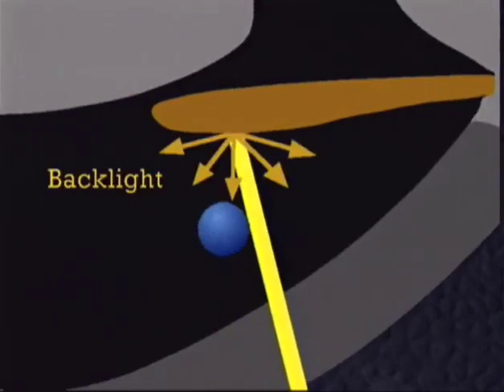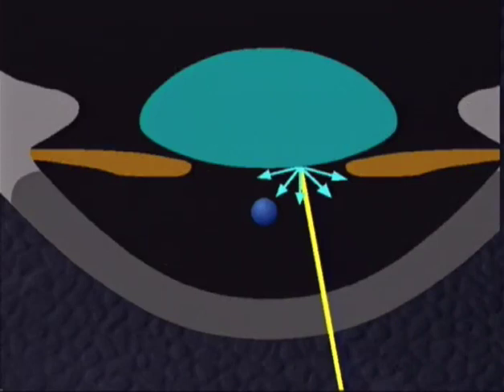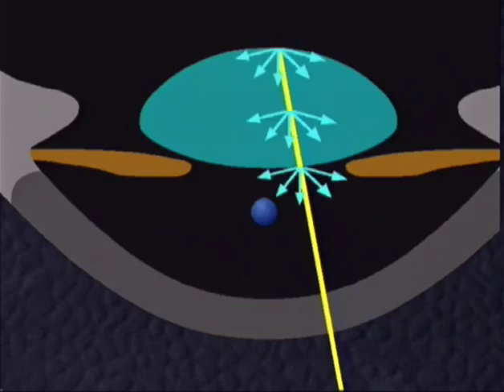Similarly, the indirect light from the iris can be obtained by directing the beam away from the target towards the iris, and from there, backlight and lateral indirect light are produced. In addition, even a transparent medium such as the lens can be made to be an indirect light source by reflexes at its anterior or posterior surface, or scattered light produced within the lens. With this in mind, we will now discuss the illumination techniques for the generation of optical phenomena in more detail.